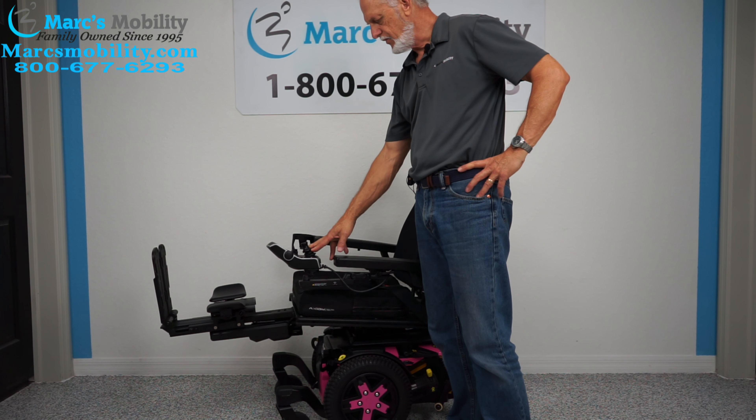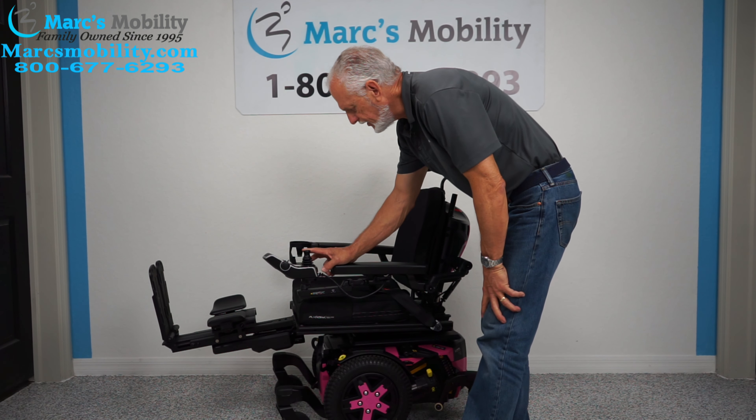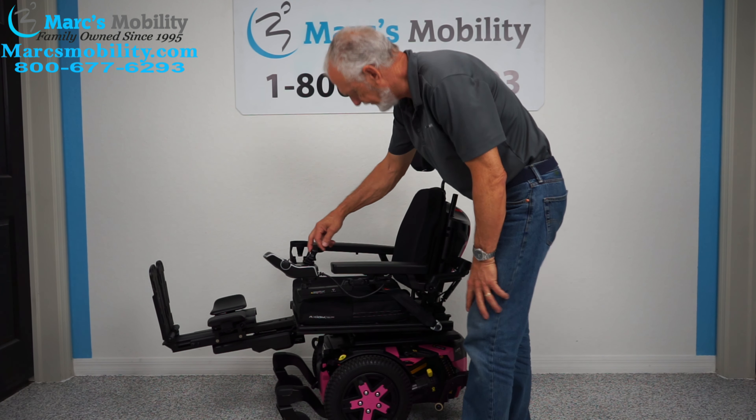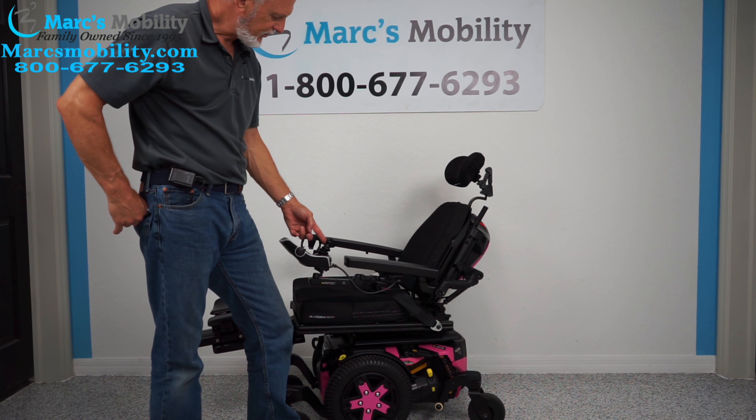The next function is called the electric recline. The electric recline is just the back going back — if you watch the back, it'll go back by itself.